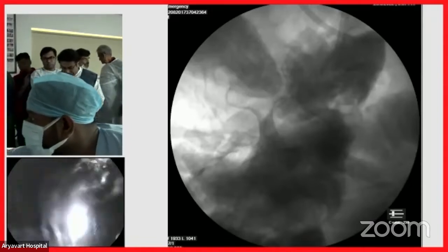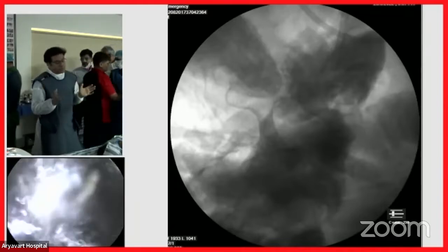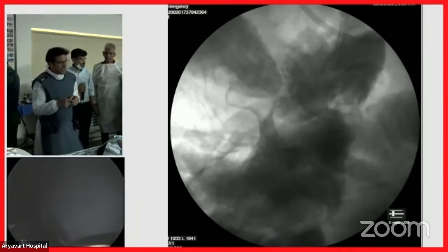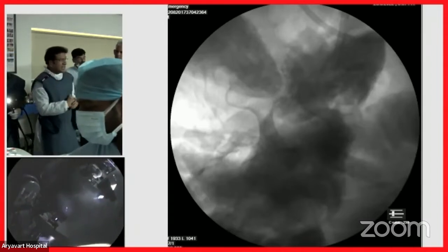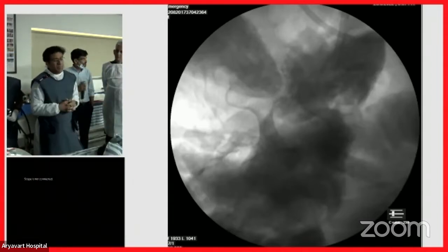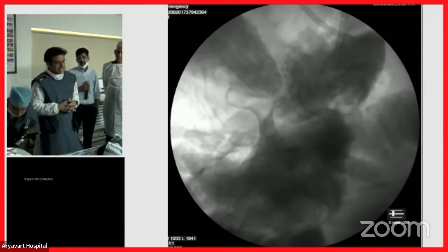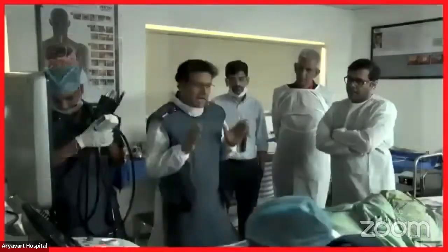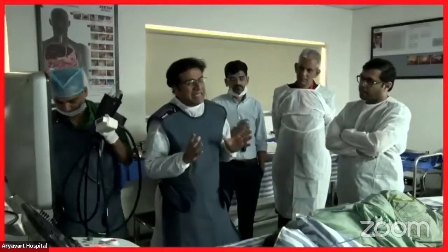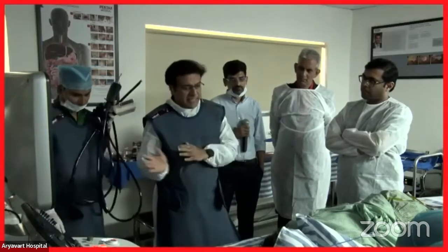Primarily, there are three techniques of doing an EUS GJ. One is the direct technique where you don't instill any fluid beforehand, you just go ahead and puncture, and after puncture, you instill fluid. The second technique is the one that we have used. And the third technique that is being asked about is the double balloon technique. This double balloon, as of now, is not commercially available. It is available in select centers. For research purposes, Dr. Takao Itoi has given it to a few centers. But I strongly feel that that technique possibly is foolproof and maybe better than this technique.